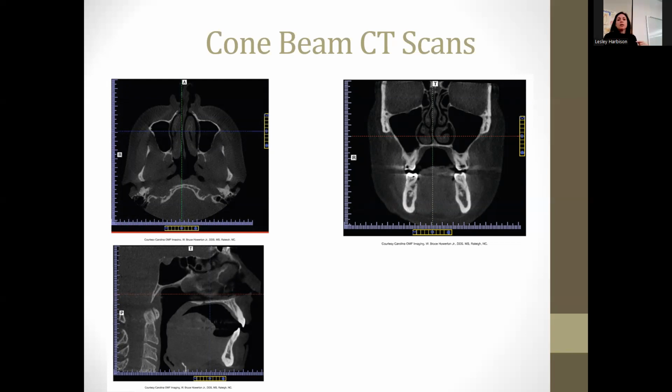So that's the axial plane. Coronal is a vertical plane that divides the features from anterior to posterior. So it'd be like cutting off the front of the face and then going posterior. So you can see layers going back. And then the last one is the sagittal plane, which is a vertical plane that divides the anatomical features from left to right. So then you're going this way. So you're seeing it in this plane. Sagittal is this one. This is the sagittal view.